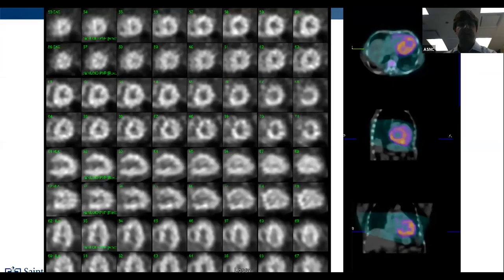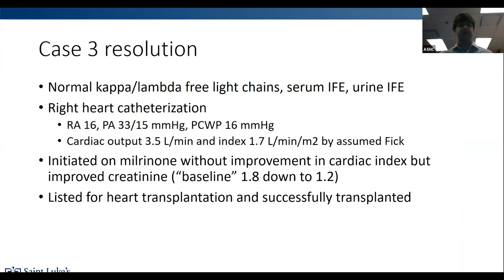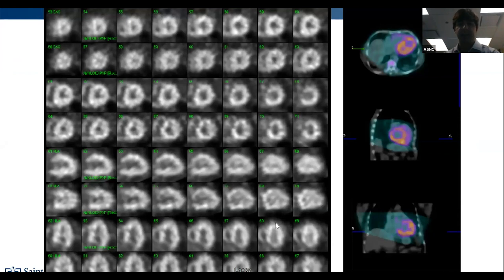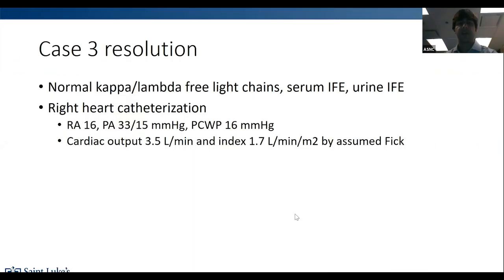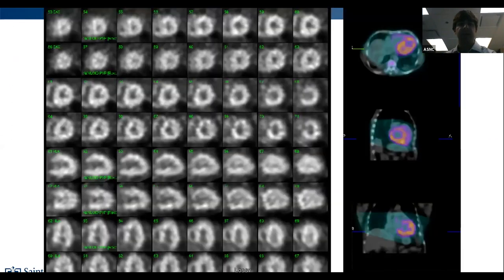Here's the SPECT image, which looks almost like a poor quality MPI here. So this patient was very sick, low cardiac output, and we actually ended up transplanting this patient. But the reason I bring this up is if you look at the uptake, what we noticed is that normally, if you have early uptake, usually it's in the septum or in more of the basal segments, and you can have some apical sparing. And I know we talk about that in echo, but you can have some apical sparing like this. And we think that for whatever reason, that is a marker of earlier type disease. But when you see more disease that is diffuse, then that may be more significant type disease. And this patient had diffuse uptake here in the myocardium, and he obviously was very sick.